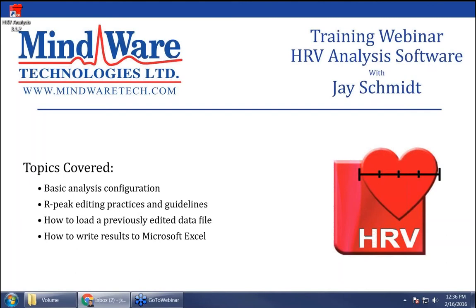Okay, so just to go over what we're going to be covering here, as you can see, we're going to be going over basic analysis configuration, just general RPeak editing practices, some common pitfalls, some guidelines that we go over, how to load these data after you've edited them if you needed to view them again, and then finally how to export these into Excel so that you can then export them to your statistical package program. Okay, so let's go ahead and get started.